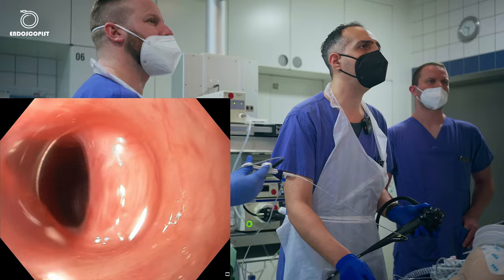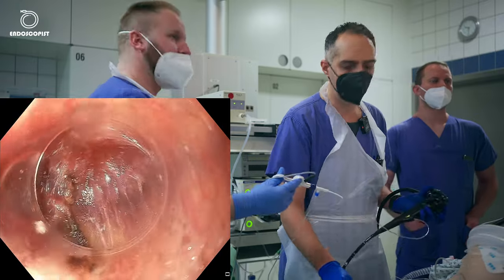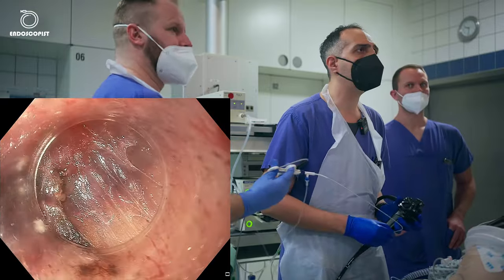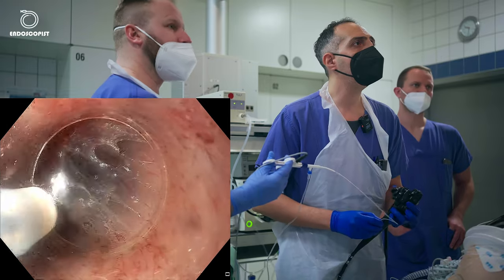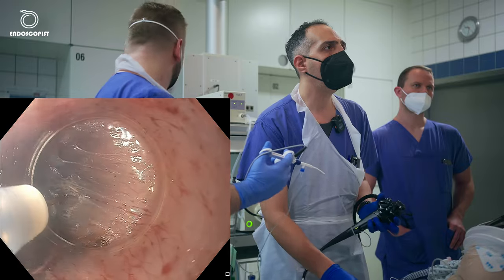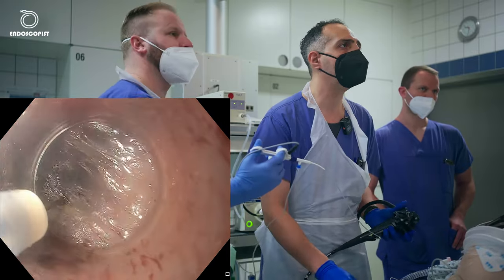We have some minor bleeding, but it's fine. So I'm here at this area. Now I think we can go a little bit deeper. So it's like 42 centimeters. As I said, I like to go 2 centimeters below the cardia, so we'll have efficient myotomy.